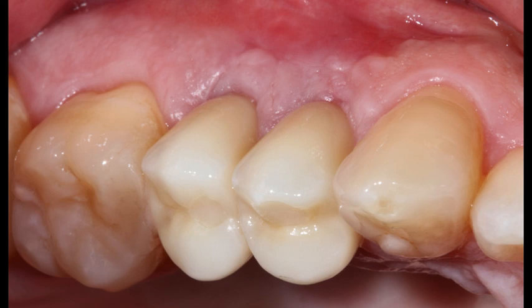So look at the contour, the natural contour that he achieved as you end this case that was so complex, and in a very simple and comfortable way for your patient, you were able to do it.